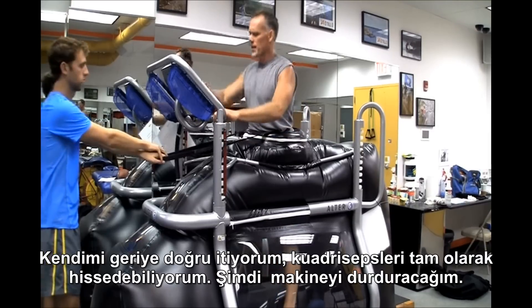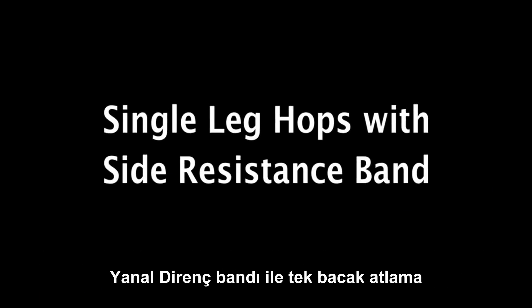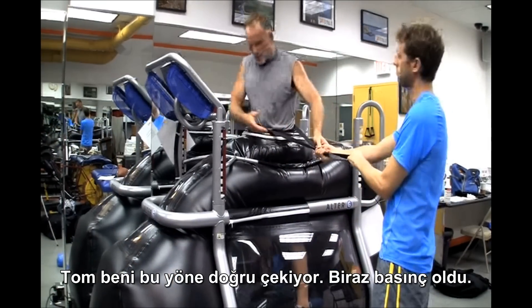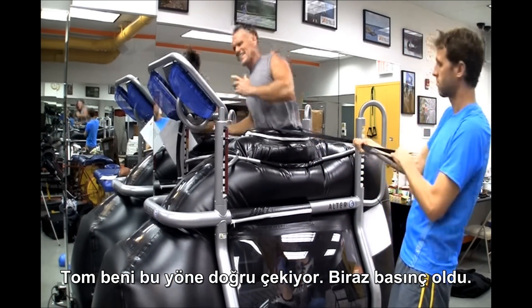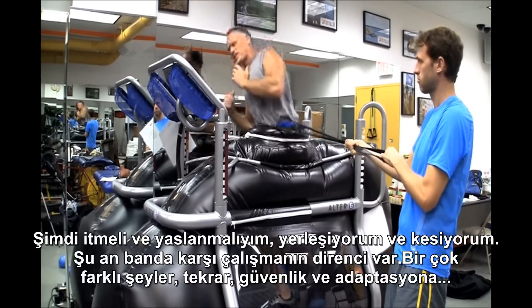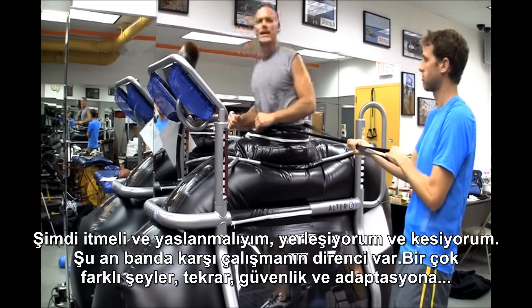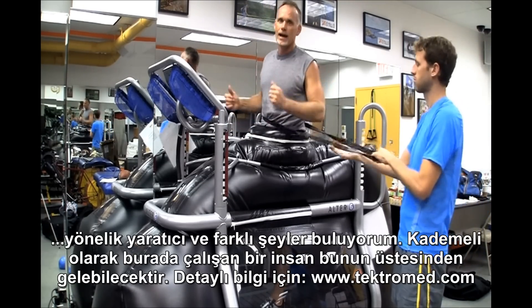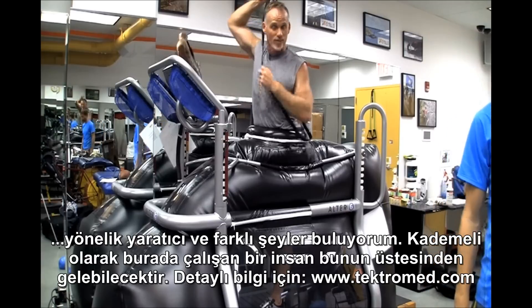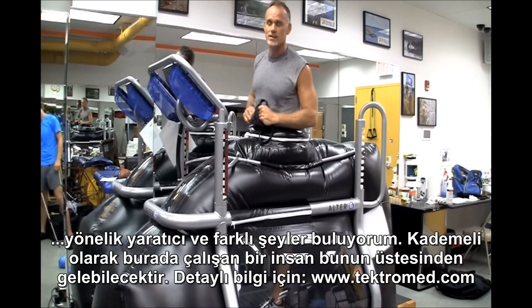Great tool. Now I'm going to bring the machine to a stop and Tom's just going to pull me that way — getting some pressure, trying to push and lean, planting and cutting, with that resistance from the band. A lot of different things — again, creativity, coming up with different things that are safe. At that stage, gradually working first to be able to handle this kind of stuff.